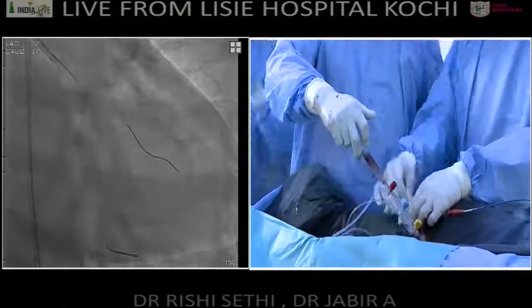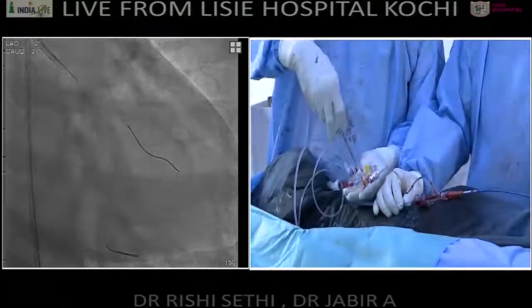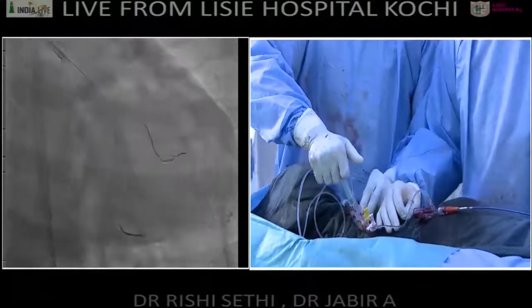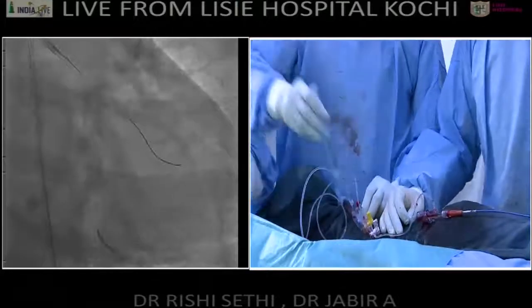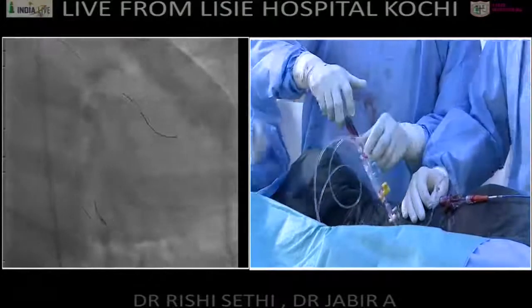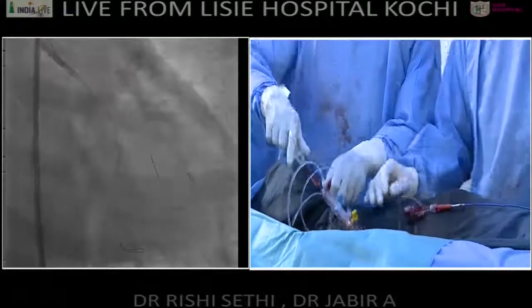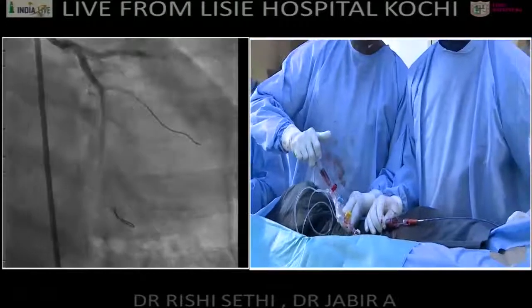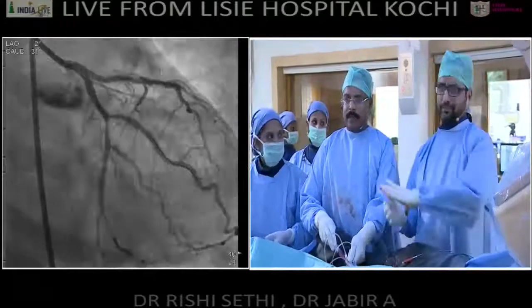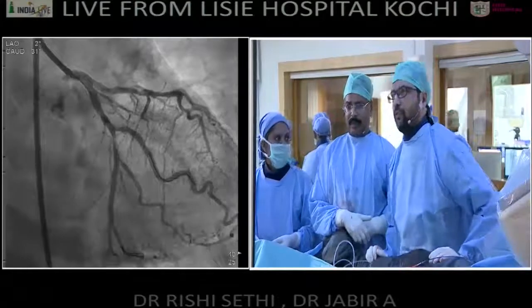Okay. Some GTN, please. Ready? You can take the wire out. We'll give an injection and then we'll take the wire out. Okay. Final signal. Now you go ahead with the FFR. I think this is what we expected.